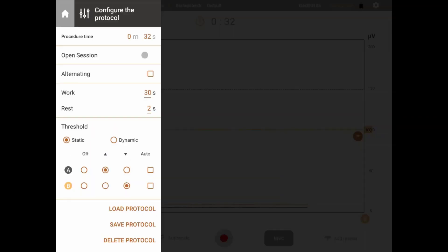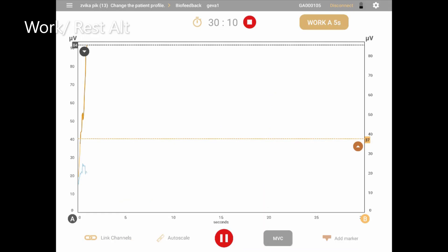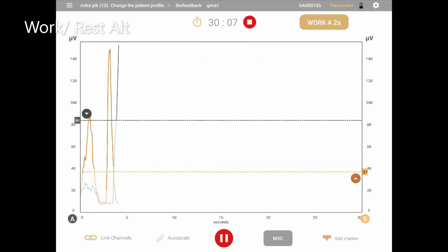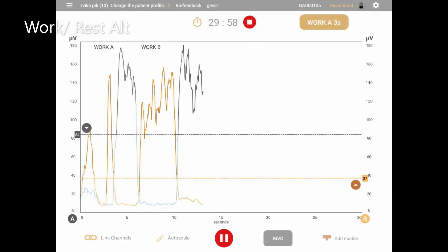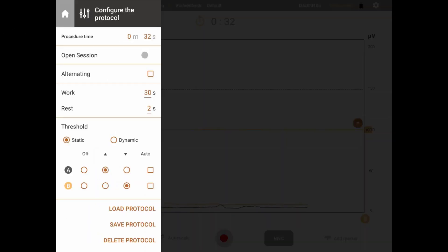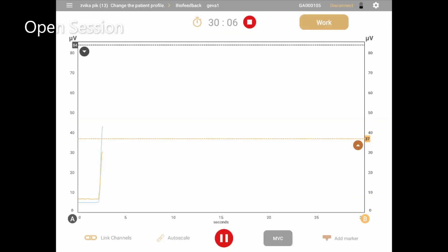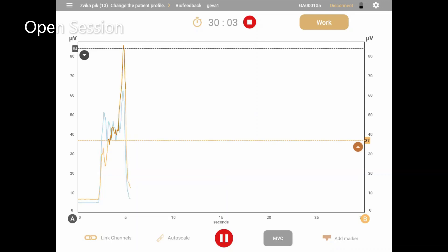The second type is an alternating work/rest session. To activate this type, check the alternating checkbox on the top of the menu. In this type, work and rest times are identical and the patient is instructed to alternate between working on channel A while resting on channel B, then working on channel B while resting on channel A. The third type is an open session — activate this mode by clicking the open session button on the top of the menu. In an open session, there are no work and rest phases and the user may instruct the patient to perform tasks as they wish. Pattern view only allows this type of session.